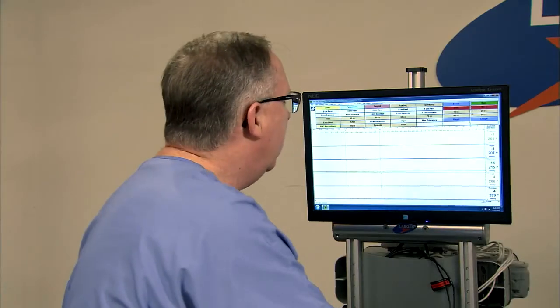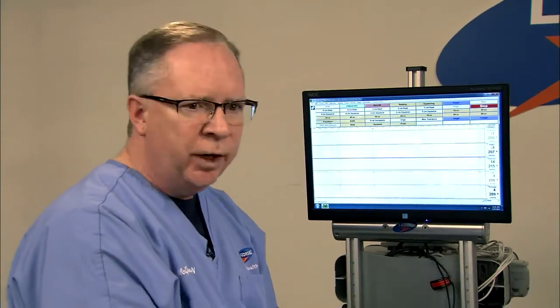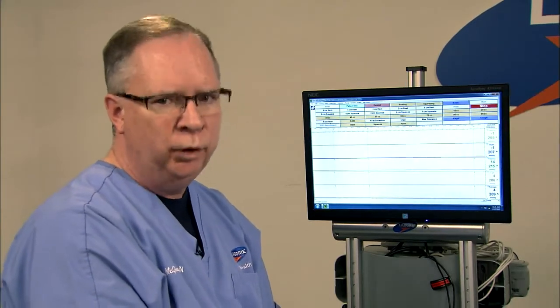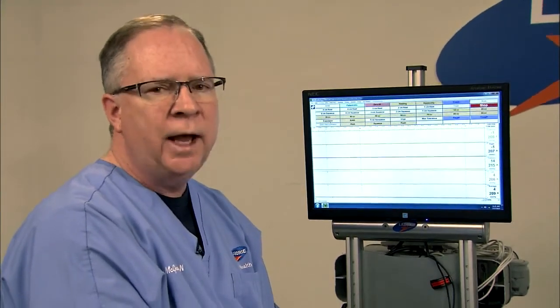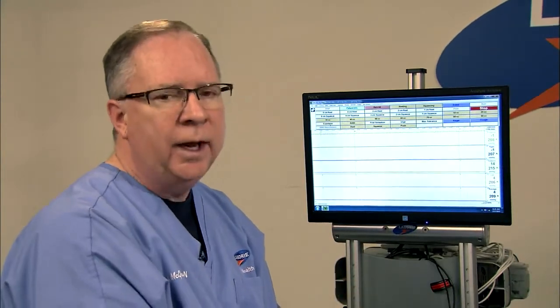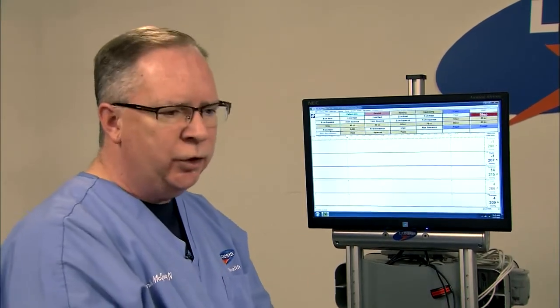We're going to click on the expulsion test button. You'll notice that it starts to flash. You'll go ahead and ask the patient to bear down, to push, whatever they need to do to expel that balloon. Some locations I've seen do it with the patient laying on their side. Some locations will actually have the patient get up into a sitting position or actually go into the toilet and ask them to attempt to expel that catheter.